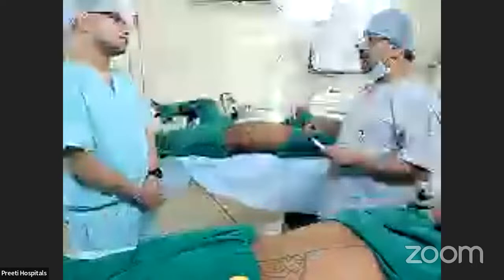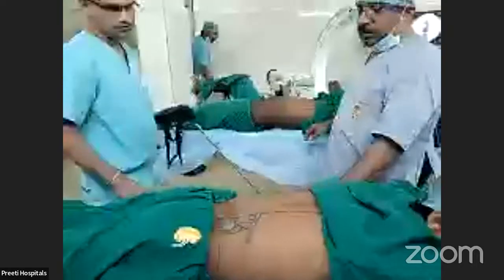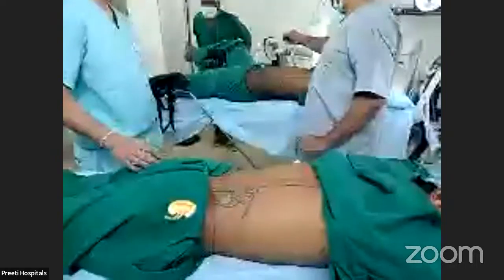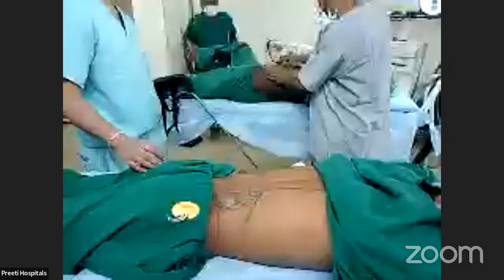Now, combinations. In combination, the patient has a pelvic stone. Imagine you have an inferior calyx stone. Like you have one pelvic stone, one inferior calyx stone. How will you approach? Coming to the same advantages and disadvantages of the inferior calyx.